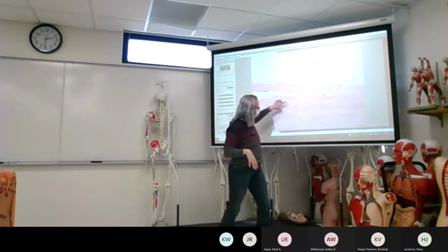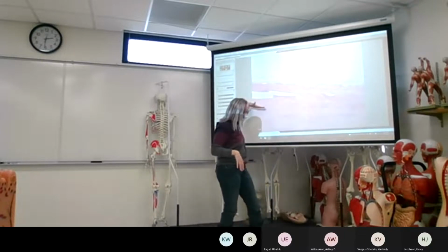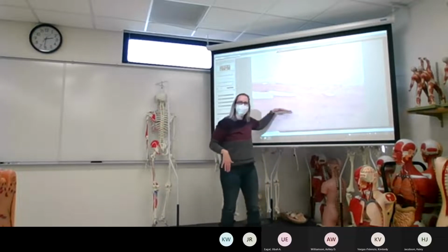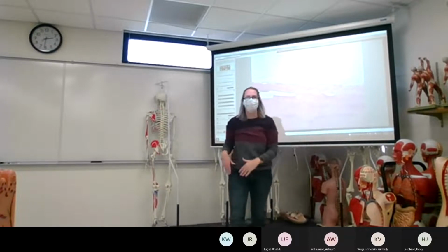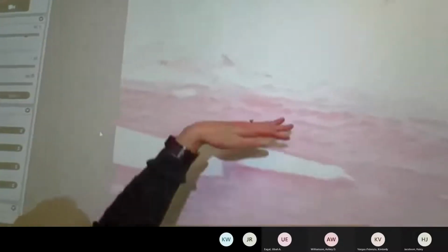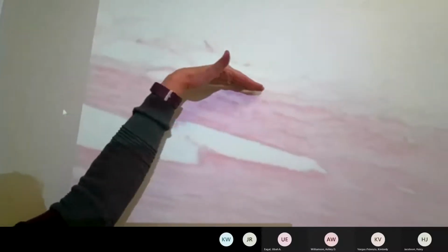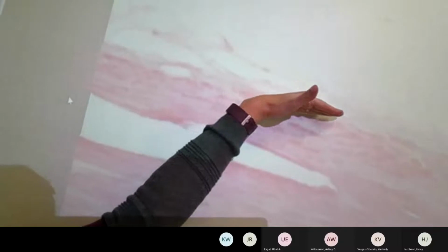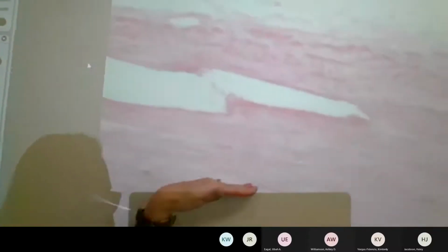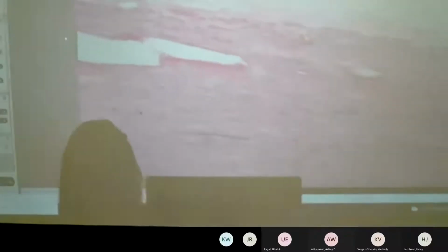And then you start to get to a lot of laid down collagen fibers oriented in the same way that is creating your ligament or your tendon. Okay, so this slide is supposed to be a ligament or a tendon. And again, there's a little bit of fat. Then there's probably, again, a little bit of a dense irregular border. Then you start getting into nice lined up fibers.